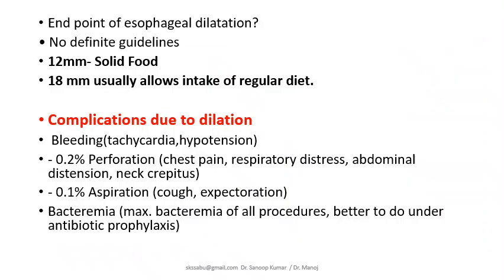So the end point of esophageal dilatation has no specific guidelines. For solid food, 12 mm is more than enough. For all regular diets, if you want to achieve 18 mm, but commonly at 12 mm or 13 mm we stop the dilatation procedure.